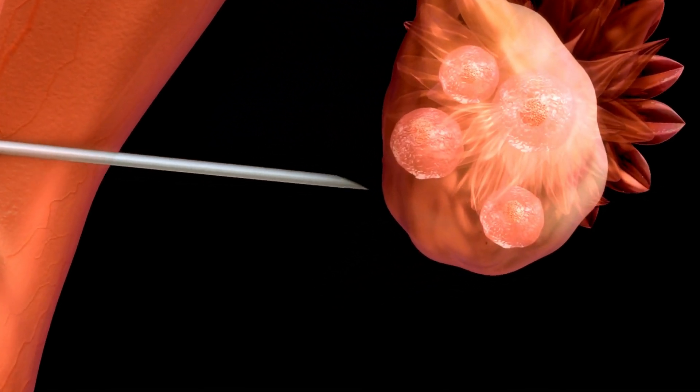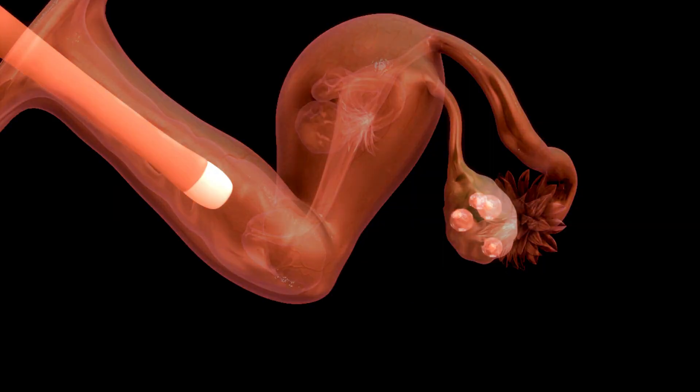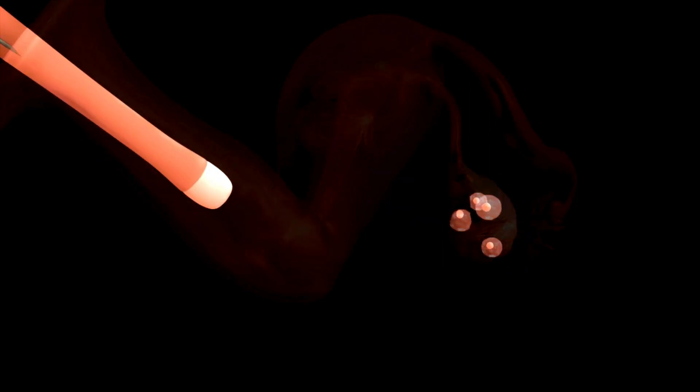The needle is guided into a follicle containing an egg, which is then pulled and pushed into the needle, moving to the test tube. This process is repeated with other ovary and follicles.